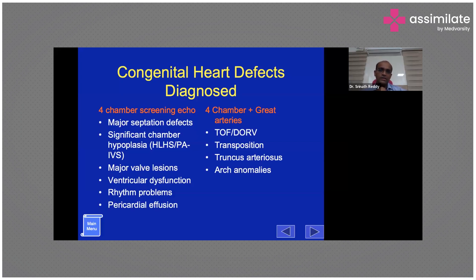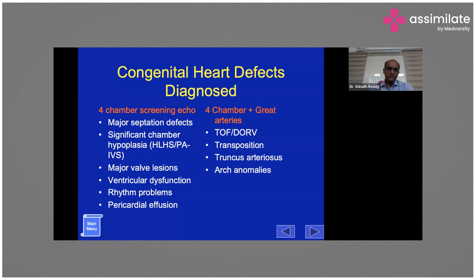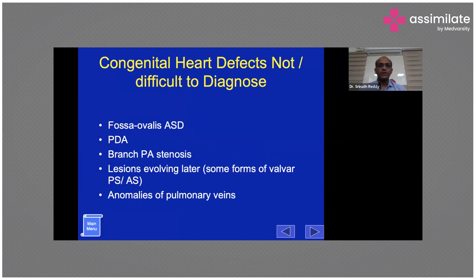When you combine the four-chamber view with the outflow view and assess the great arteries, you can diagnose conditions like transposition of the great arteries, Tetralogy of Fallot, DORV, and truncus arteriosus. Most arch anomalies require the next level of assessment, but with four-chamber and great artery assessment you can diagnose the majority of significant problems.